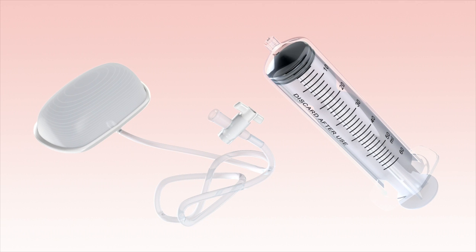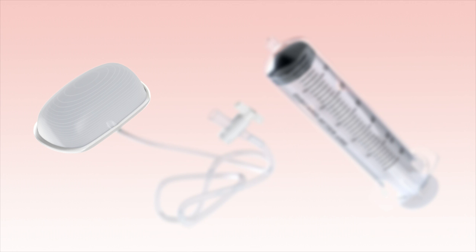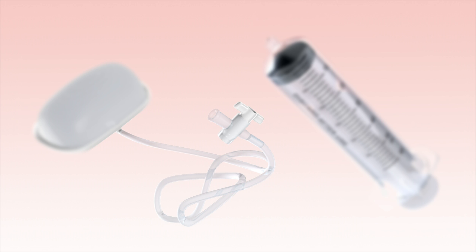The device consists of a soft silicone balloon attached to a firm base plate that can be folded to allow easy insertion. There is a 100cm long tubing with a two-way tap at the distal end to inflate and deflate the device. The device comes sterile packed with a 60ml syringe.